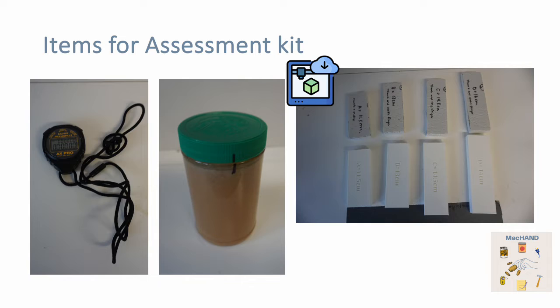The logo on the top left corner of the slide's image indicates that this item can be 3D printed to increase the standardization of the test. We always encourage you to use the 3D printed versions of these items when possible. The link to the 3D printable files can be found directly on the MPA-S Instructions and Scoring Manual PDF.